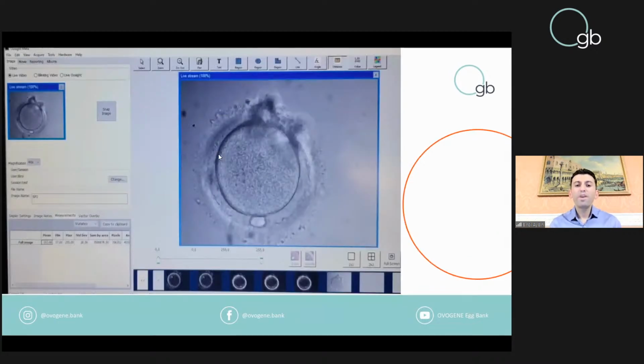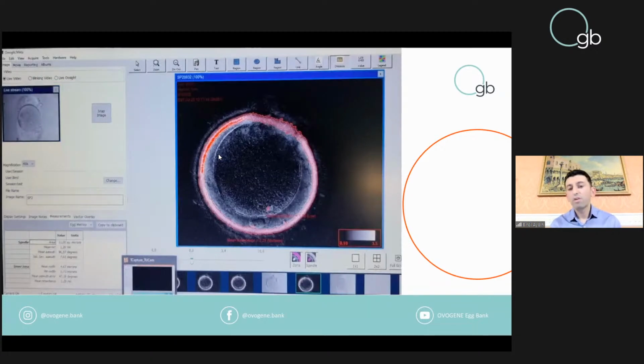So how do we connect the system to meiotic spindle determination? Firstly, a regular image is coming from the oocytes. For these oocytes, our target is to get the exact location of the meiotic spindle, but from the background, the tools are also measuring different parts of the oocytes, such as the polar body, perivitelline space, diameter, inner diameter, outer diameter, and also, in the next slide, I will show how the zona configuration looks.